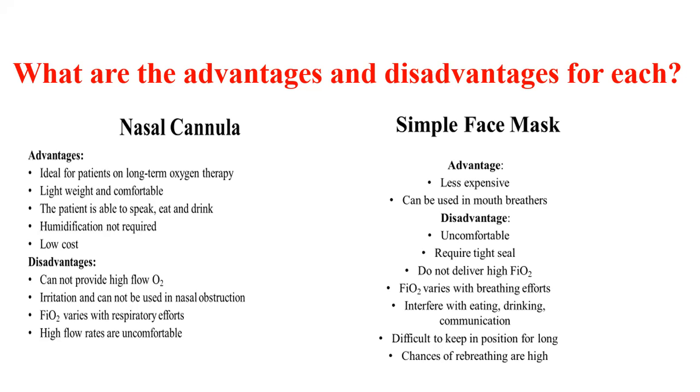It's lightweight and comfortable for the patient. The patient can speak with it. He can eat or drink, and it doesn't require humidification, and it has a low cost.